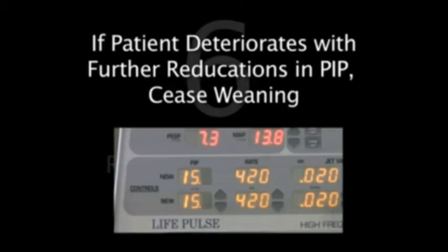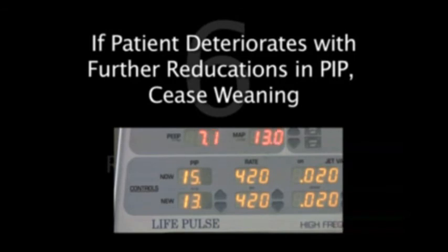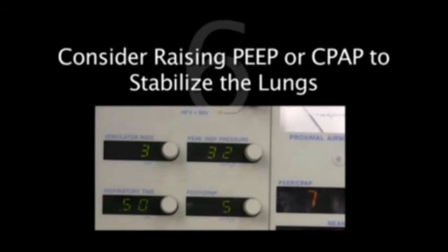Sixth, resume weaning PIP, and do so as tolerated. If the patient begins to deteriorate with further reductions in PIP, the pressure may be near a mean airway pressure threshold. In this case, cease weaning and consider raising the PEEP or CPAP to stabilize the lungs. Resume weaning when the patient is ready, as determined by blood gases and clinical observation. And if possible, you may continue to wean FiO2 during the interim.